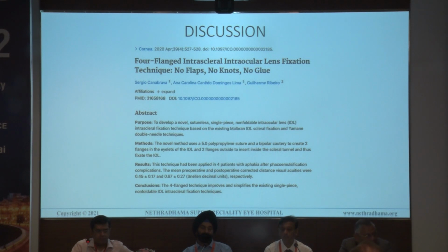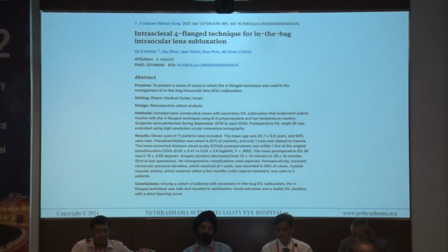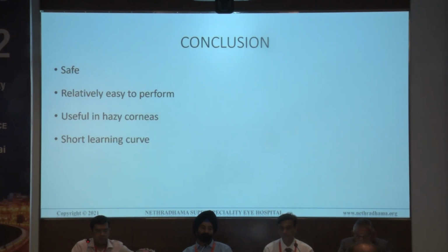This four-flanged intrascleral technique was better, but then our novel technique simplifies, improves and quickens the single-piece non-foldable IOL intrascleral fixation technique. It also has a lower cost and easy learning curve because it is based on existing scleral suture fixation techniques. Our experience spanning the intraoperative and 18 months postoperative course suggests that this technique of SFIOL fixation is safe, relatively easy to perform, useful in hazy corneas and has a short learning curve.